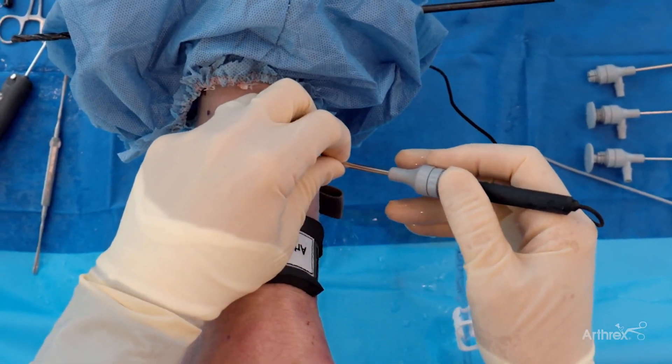We'll switch over to the inside of the joint here. Basically you can see we're inside the ankle joint, and how quickly I can get to the back, whereas normally that's harder to do. The smaller 2.7 scopes bottom out, and the larger 4.0 sometimes can't fit in here, but I'm easily all the way to the very back of the tibiotalar joint. You can see the difference in having such a smaller instrument — you get a feel of that wide view, straight on, not looking around the corners. We're looking at the tibia above, the talus below.